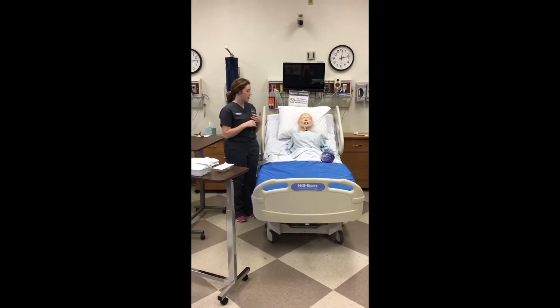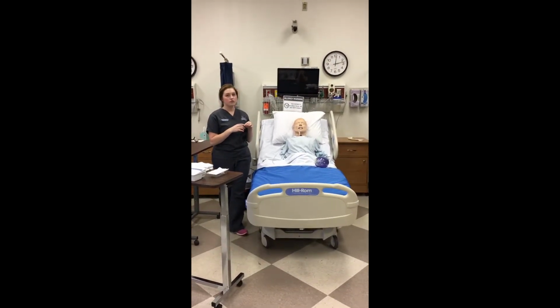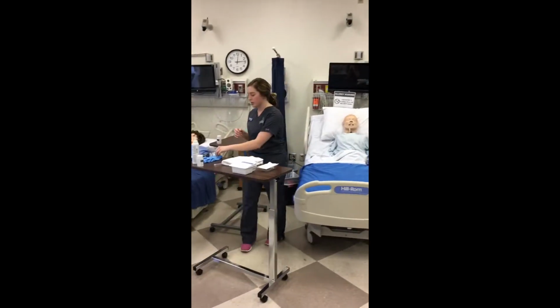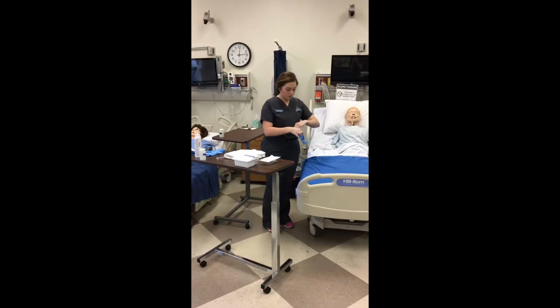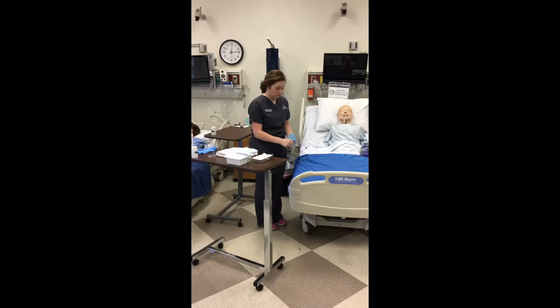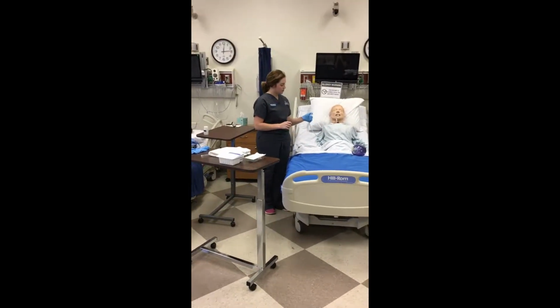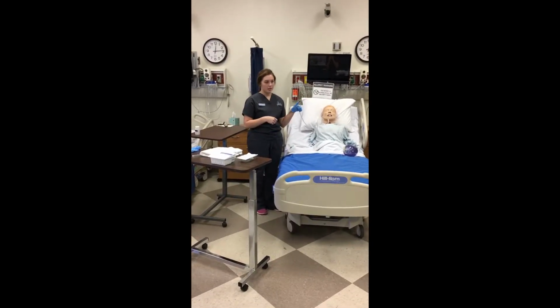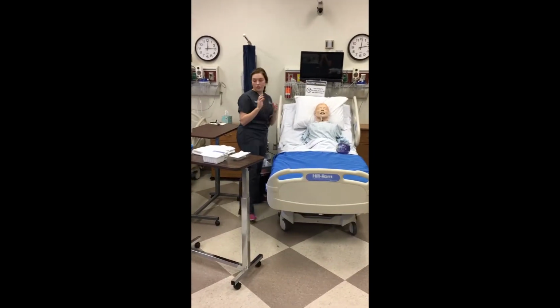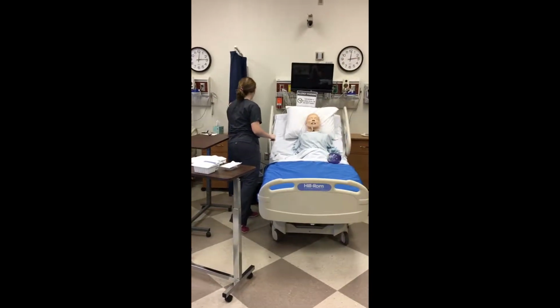So now what you're going to want to do is make sure your suctioning is turned on to 80 to 120 millimeters of mercury. And how you're going to test that it's properly working is put on a clean glove. Pick up the end and just lift your thumb and just make sure that suction is working. Now you're going to remove this glove, wash your hands, and provide privacy for the patient.